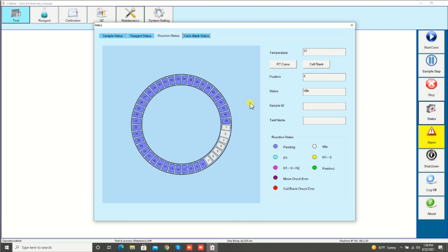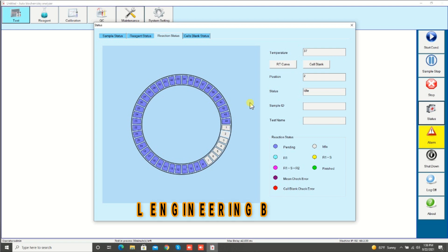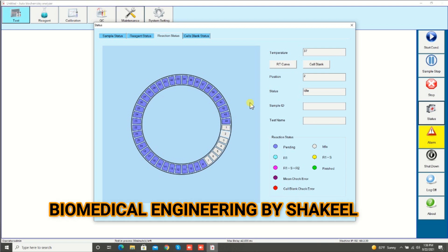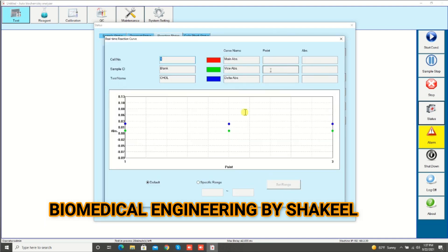The first step is the machine will add reagent one — once the machine adds reagent one, the color will turn blue, as you can see. After that the machine will add the sample and the color will turn yellow. If you want to see the reaction curve, click on RT curve — it will show you the live absorbance versus time curve.